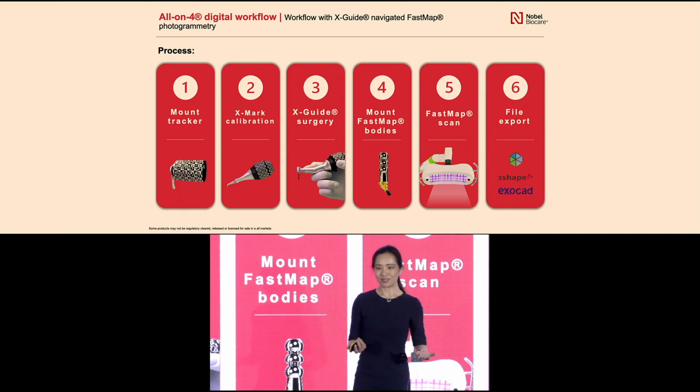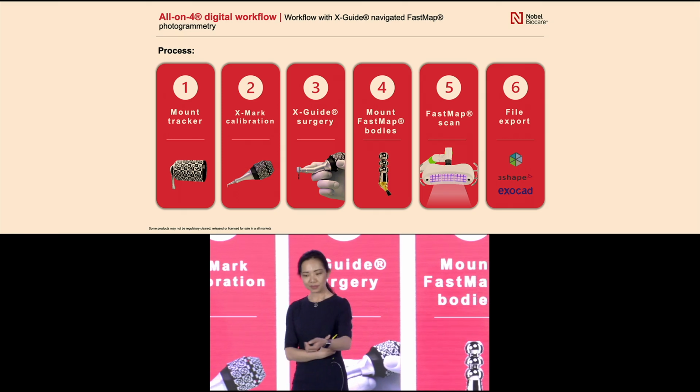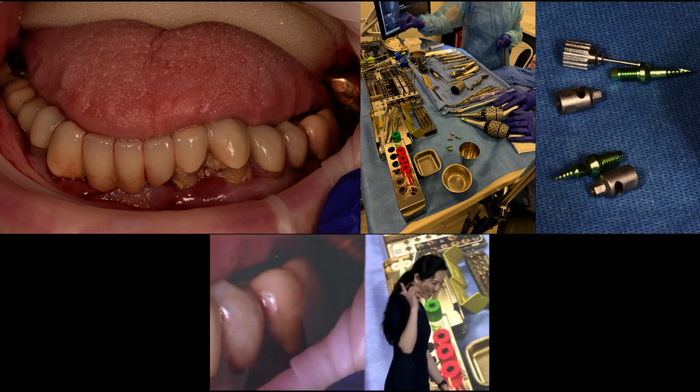Technically, I don't have to be at this surgery because all the equipment's already at the office. And that's it for now. I'm just kidding. So I'm going to walk you through the case.